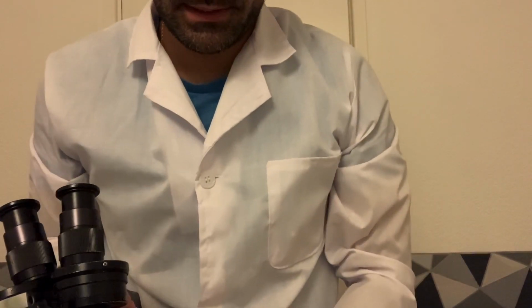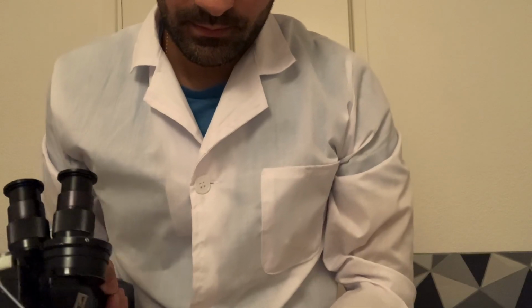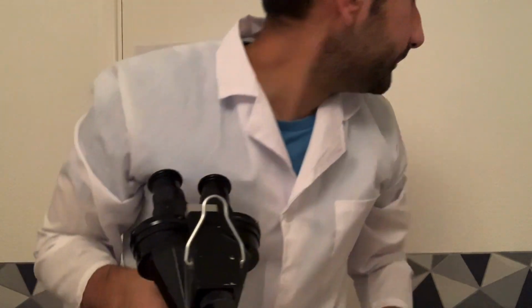Okay, so let's see if we can obtain a look with the blue light now. Okay, looking straight ahead now, just straight. Okay, this just enhances my view a little bit better. Okay, and to the left eye now. Keep looking straight, doing a fantastic job.